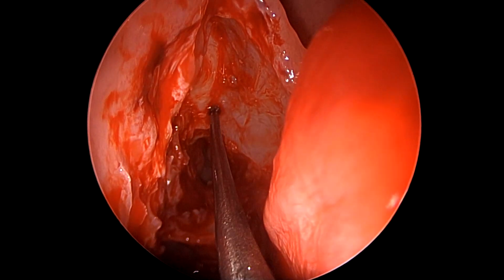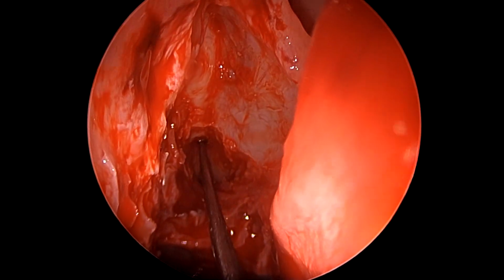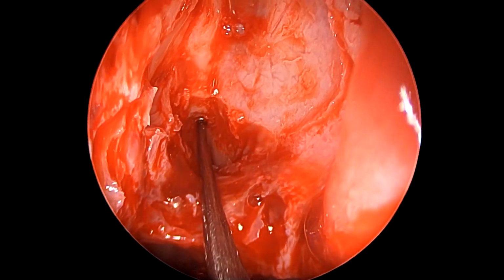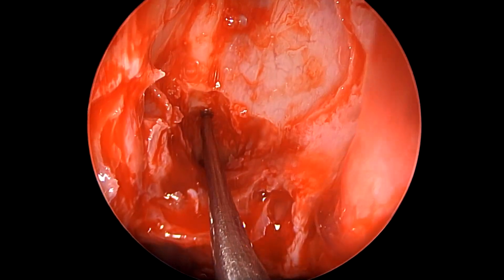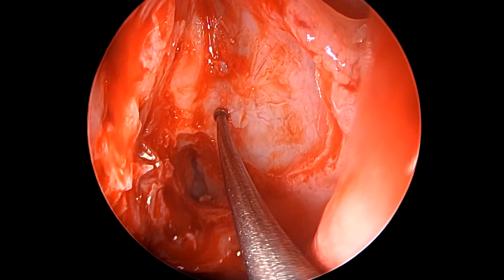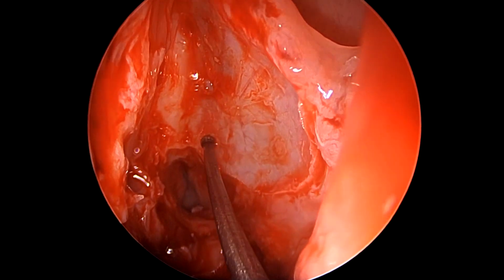So now we have shifted to a 70-degree camera, a 70-degree endoscope, and are using a ball probe to see if we can insinuate the thin ball probe inside the frontal recess. And you can see the frontal beak there clearly. It's a thick beak on which the instrument is being pointed. This is a thick frontal beak.